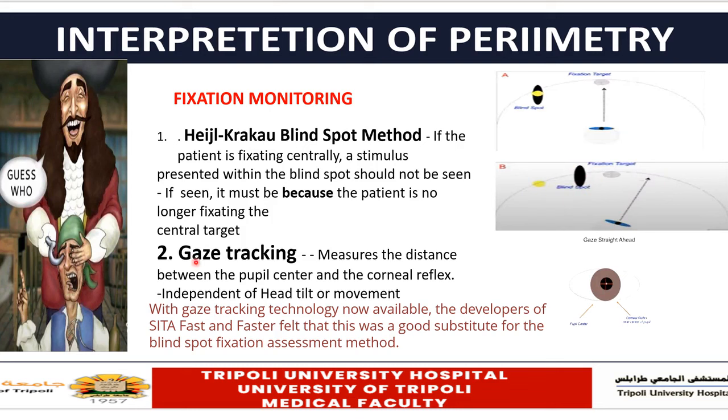The other method is the gaze tracking method. This gaze tracking method is more reliable and more precise than the Heijl-Krakau method, and it uses real-time image analysis to verify that the patient is looking at the fixation target.